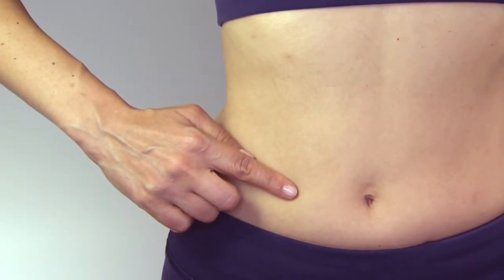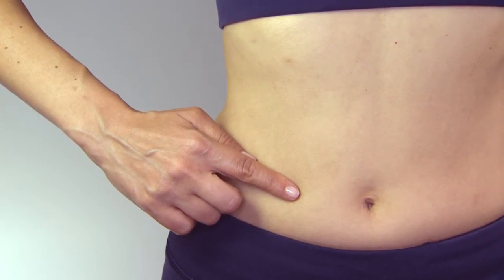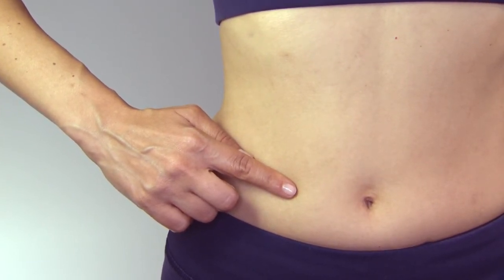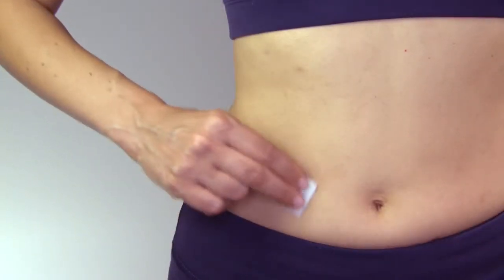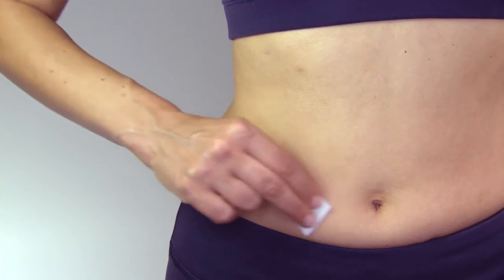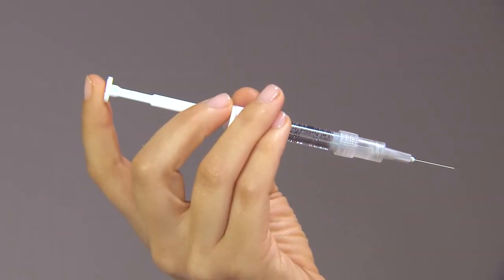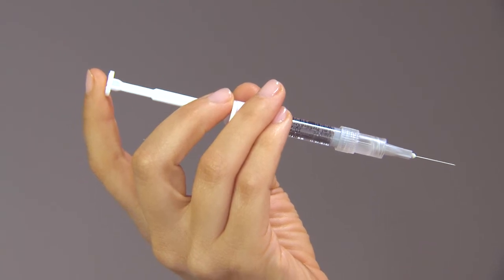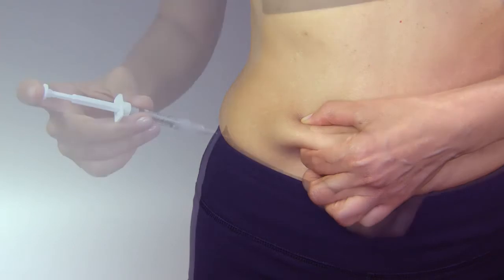Step 3. Inject. Choose an injection site in the lower abdominal area, preferably around the belly button, but at least 1 inch away. Choose a different injection site each day to minimize local irritation. Take an alcohol wipe and clean the skin at the injection site and allow it to air dry. Hold the syringe with one hand the way you would hold a pencil.